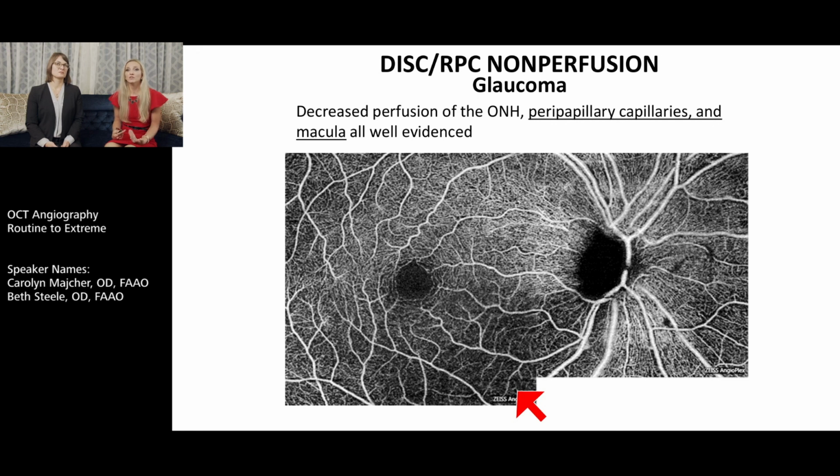So it's going to be another tool that we have in our tool belt, I think, to monitor and even potentially diagnose early glaucoma.